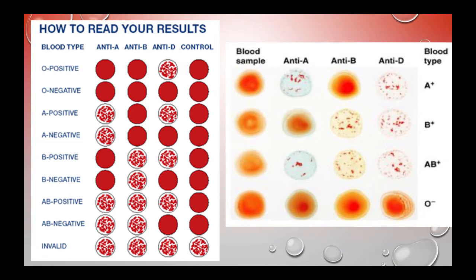I will actually do some blood typing for you, and you'll get to see some of this. So if we had you in the lab, you would actually do the blood typing, and hopefully one day we'll be able to send out kits, but we don't have that capability just yet. So you could do your own blood typing, but it's always fun, right, to do your own blood typing and prick yourself. That's the hardest part, is pricking yourself.